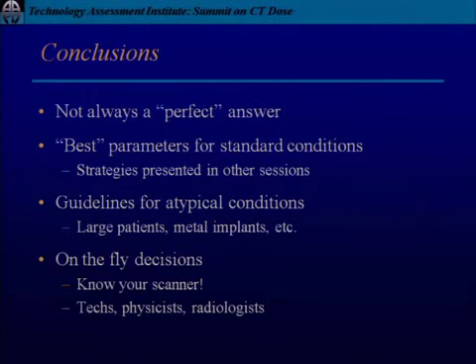So the slides that you spoke about, I just wanted to make sure that we're clear that that's about axial scanning, not helical scanning, because in helical scanning it's different. Helical as well, because that penumbral region can't be used. But the penumbra is on the edge of that beam width, so it's on the edge of that 40 millimeter beam width, not a 0.625 millimeter beam width. Right. The thinner collimations is where that gets really exaggerated.